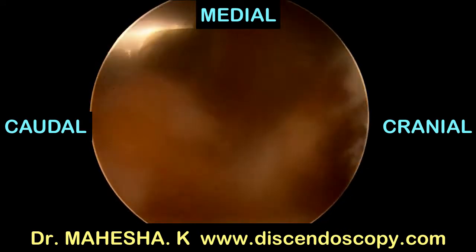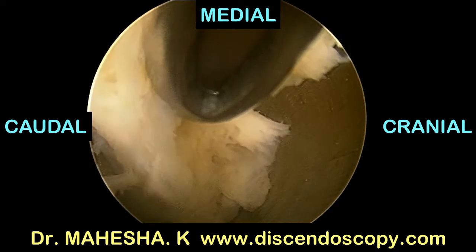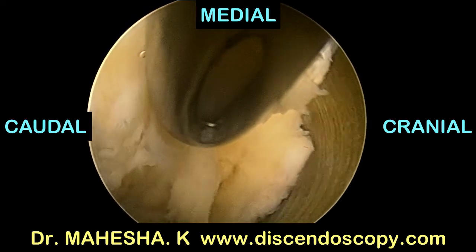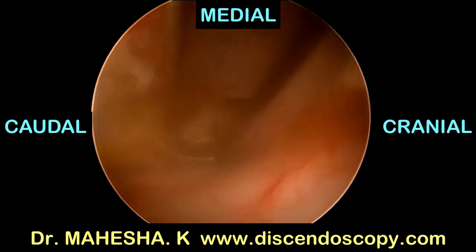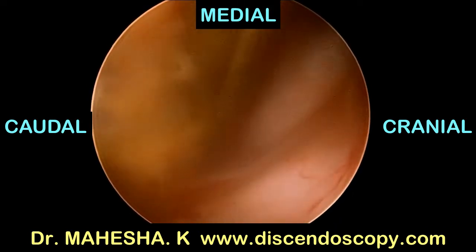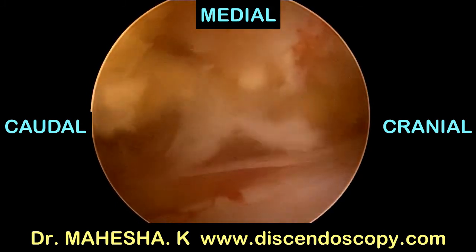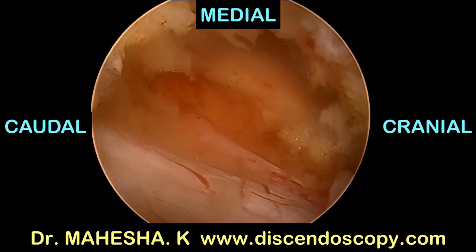Once the flavum is released from all four sides, it can be picked up and removed en masse as one piece. Now we complete the decompression by doing over-the-top decompression.